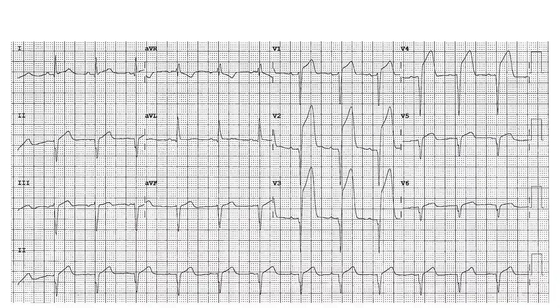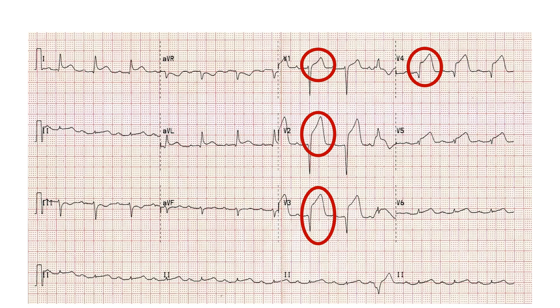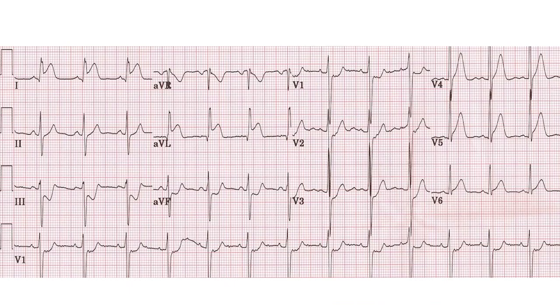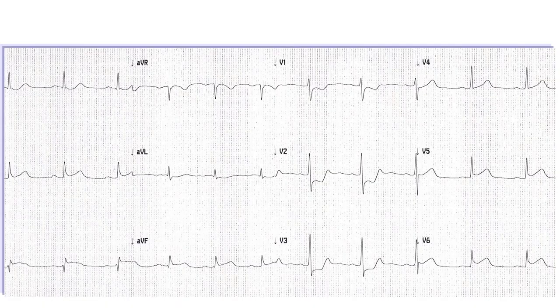Looking at these examples: one of my patients shows quite impressive ST elevation in V1 to V4 — that is an anterior wall STEMI. Another has ST elevation in V1 to V4 plus leads 1, AVL, and V5 — that's an anterolateral wall STEMI. Another example shows ST elevation in 1, AVL, V5, and V6 with no elevation elsewhere — a lateral wall STEMI. And ST elevation in leads 2, 3, and AVF gives you an inferior wall STEMI.